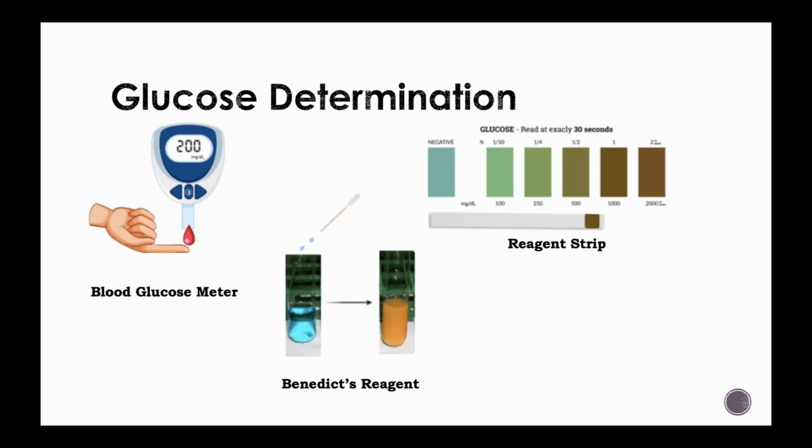The next glucose test we did was a reagent strip on the urine. We just added some urine to the reagent strip and waited a bit to see what reaction would pop up. The chemistry behind this one is that the glucose in the urine will do pretty much the same thing as in the glucose meter, but this time it reacts with horseradish peroxidase and potassium iodide to oxidize, and this causes a change of color depending on the amount of glucose.